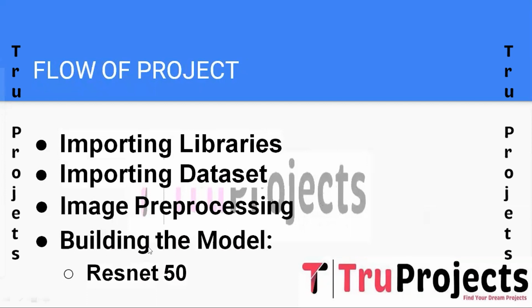And the fourth step is building the model. In this project, the ResNet 50 deep learning architecture is selected as the backbone model for the brain tumor classification. ResNet 50 is renowned for its deep layer architecture, enabling it to extract intricate features from the images. Through transfer learning, the pre-trained ResNet 50 model is fine-tuned on the brain tumor dataset to adapt its knowledge to the specific task of brain tumor classification.